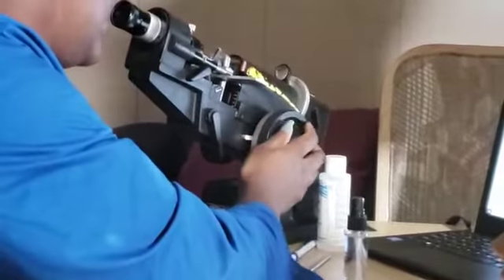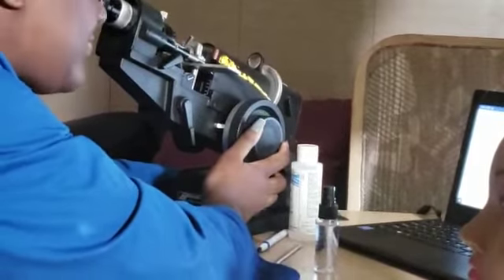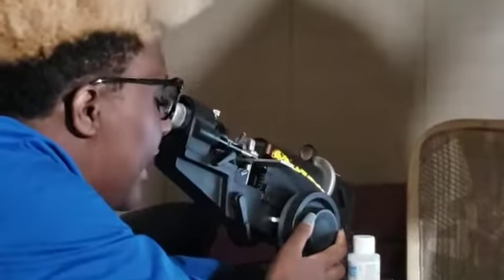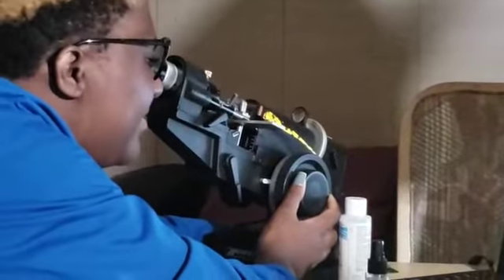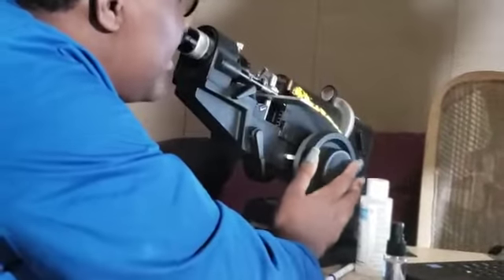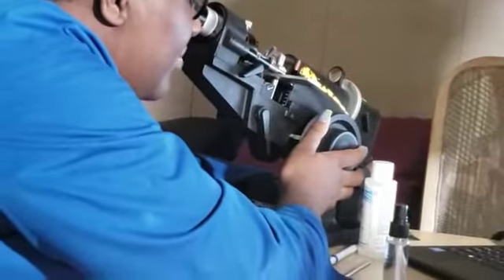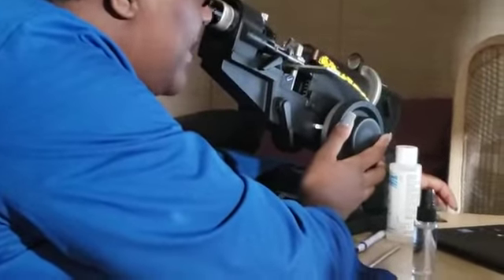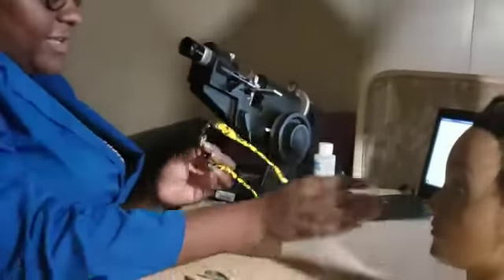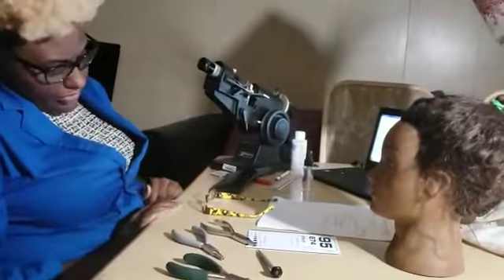Moving on to our left lens — once we verify that cylinder lines are clear at a minus 0.50, we want to check our reading portion at a plus 1.75. So we move it down so that we can read our reading portion. Once we verified our plus 1.75, we do see that it is also clear. Once we verify that what we ordered is what we actually received in the lab, we would take our lens out of our lensometer and check for horizontal and vertical alignment.